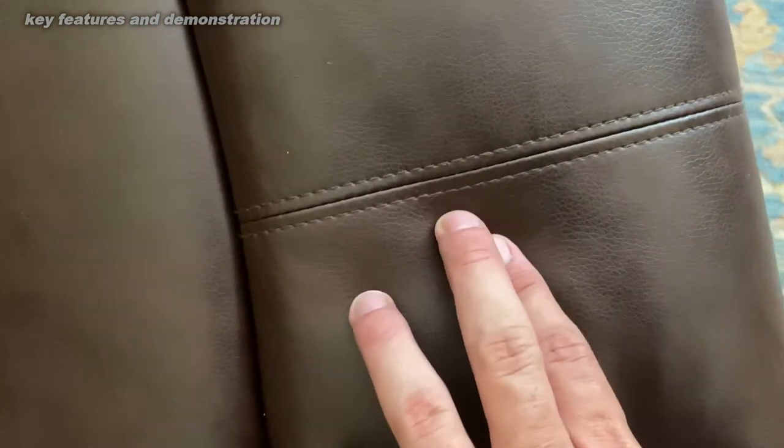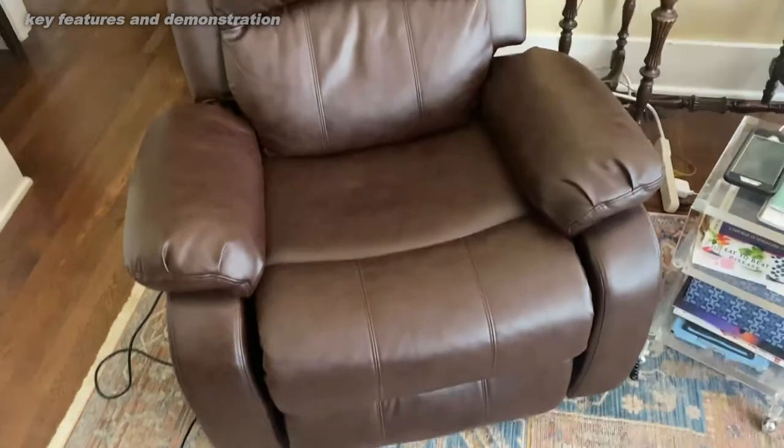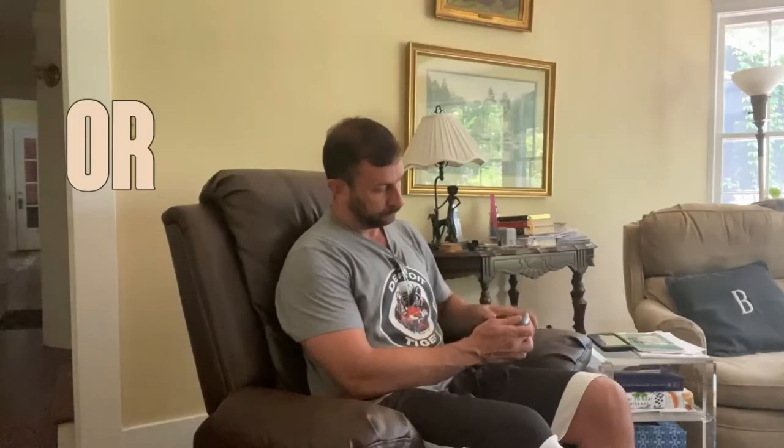The chair itself, you can see, we've had this for over a year and it's holding up very well. Nice leather, easy to clean. That's important for a lot of people with any type of issues with bladder or anything like that. It's easy to clean. And just overall, a very nice chair.